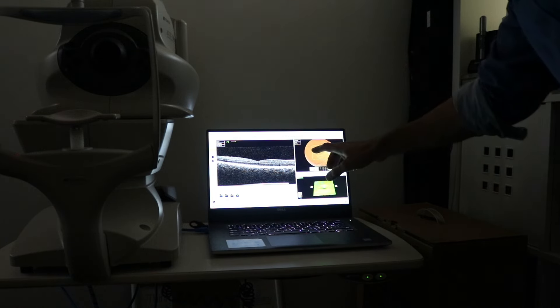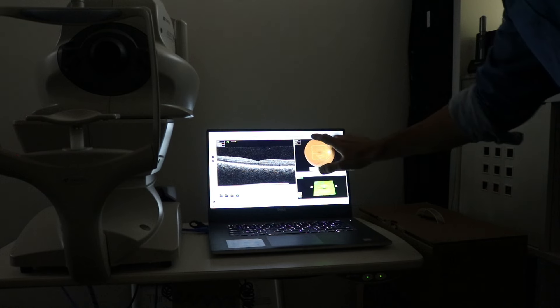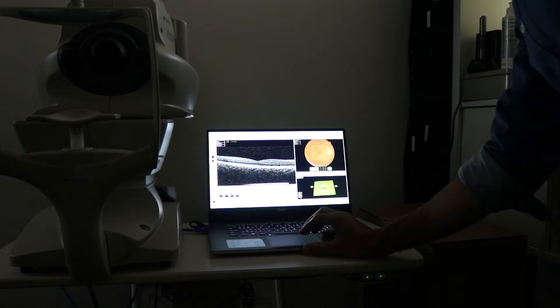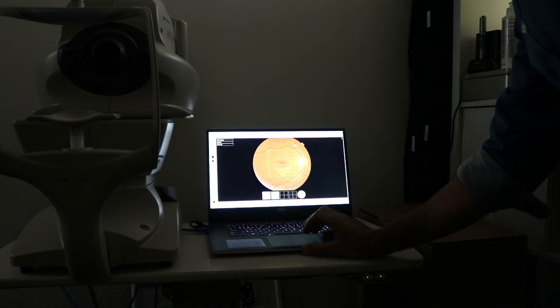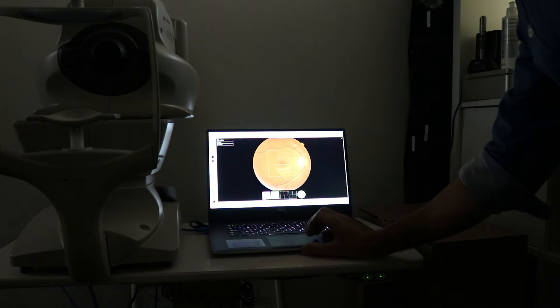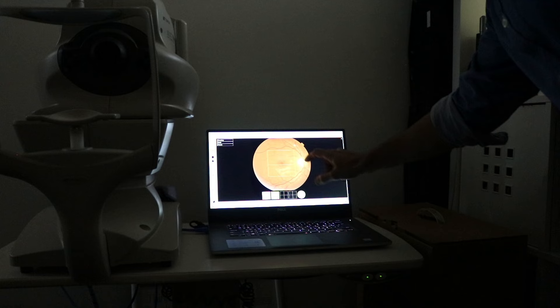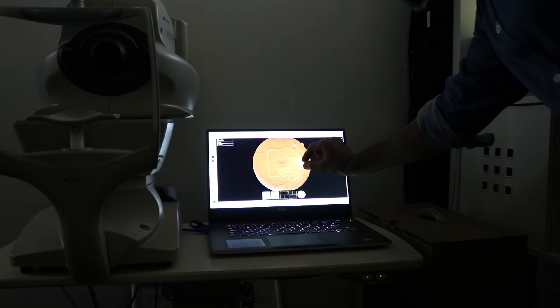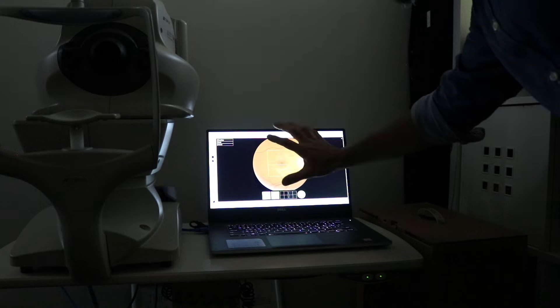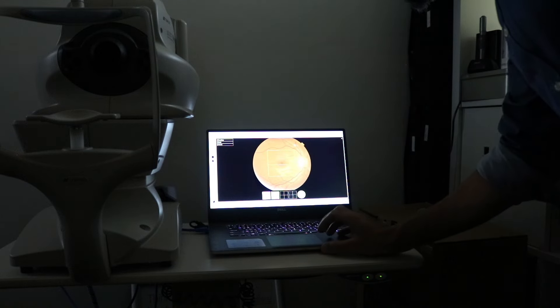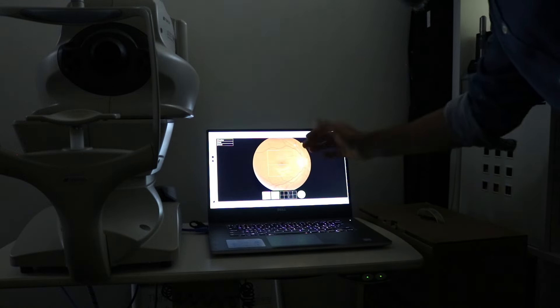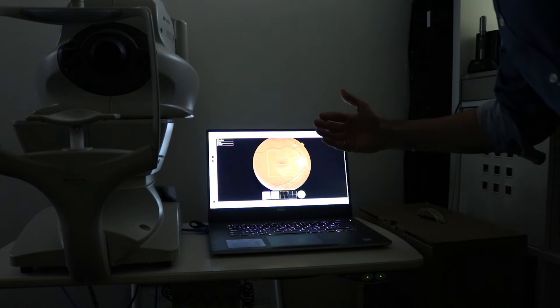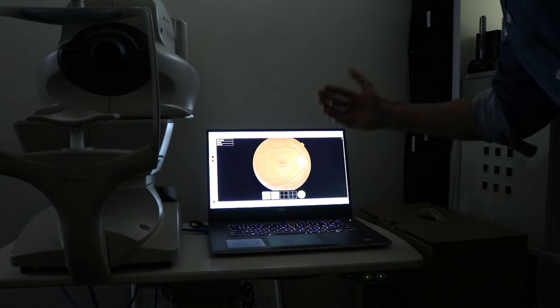So when someone goes for diabetic eye screening, it is the surface image that is being taken to grade and screen for diabetic retinopathy. What we're looking at is the optic nerve head, where all the nerves collect before going to the brain. From here, you get your blood vessels that supply the inner part of the retina, and the redness in the background makes up the blood vessels supplying blood to the deeper parts of the retina.